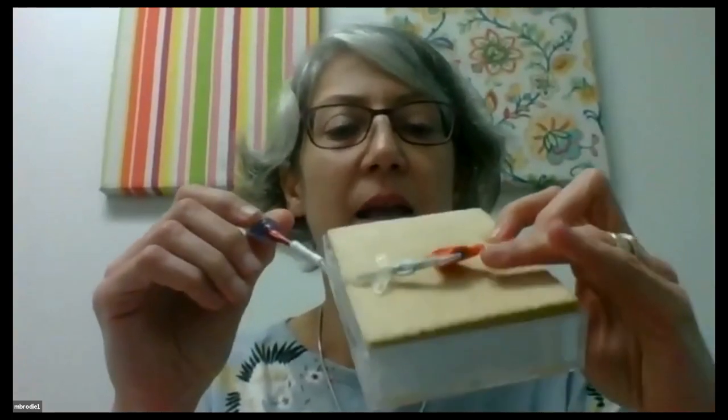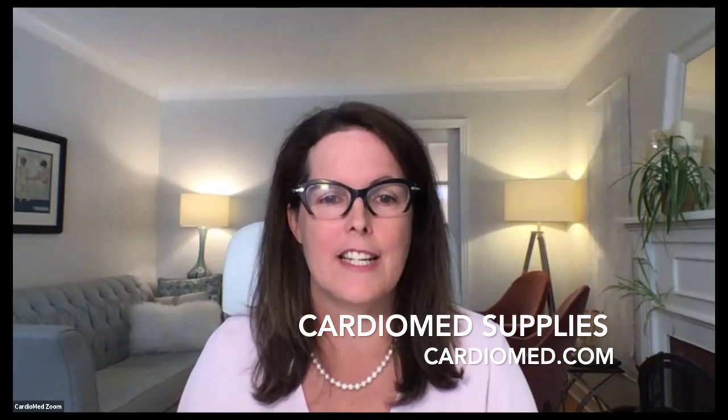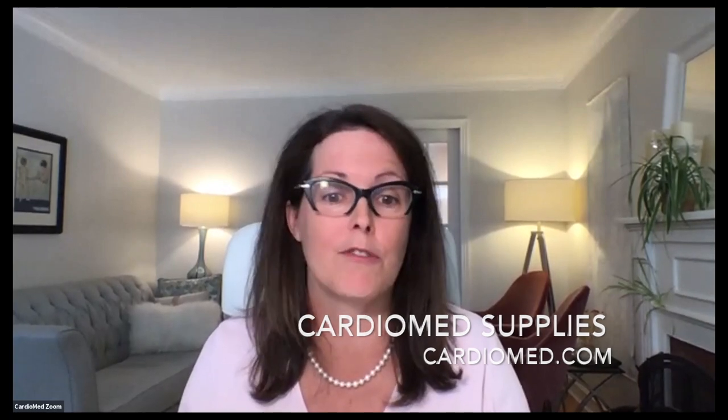And can I just put a plug in for these little kits that have a PICC in place and allow you to practice. So when I've got nurses who are inexperienced or just need a little refresher and they're asking for support, because I can provide elbow to elbow support, I just take this with me. We practice before we see the client, and then they have a little more confidence when they go in to do it with the person. So if that's possible, sometimes that's a good way to go, just so that you have some practice. Yes, certainly, when CardioMed provides in-servicing, they provide the demo boards to the educators of the organizations so that you can sustain that education, train the trainer, and make sure the clinician is competent with the procedure before they either dress or remove the device.